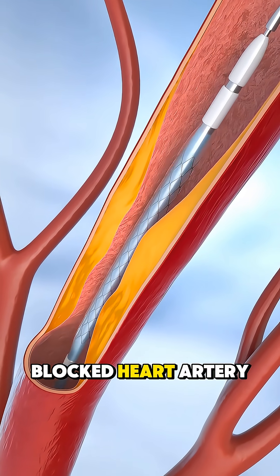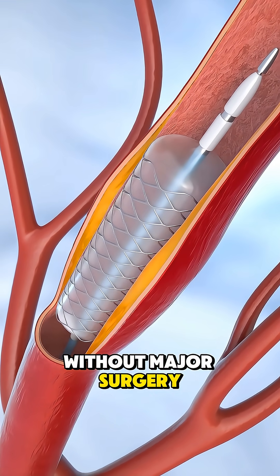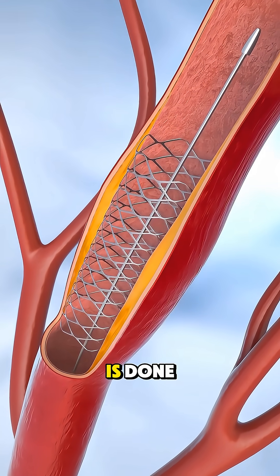Ever wonder how doctors open a blocked heart artery without major surgery? Here's how angioplasty is done.